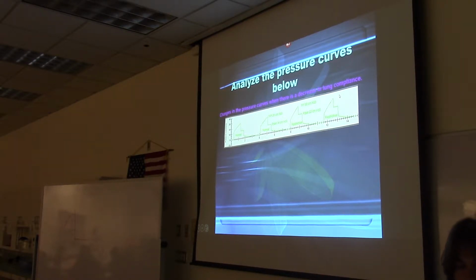All right, so what information can we gather from this? Breath number 2, PIP is 28. Breath number 3, the PIP is 36 centimeters of water. So we know that pressure increased. Could the pressure increase be due to airway resistance, or could it be due to stiffness of the alveoli? So the way to answer that question is to know that when the alveoli become stiffer, the plateau pressure reading goes up.